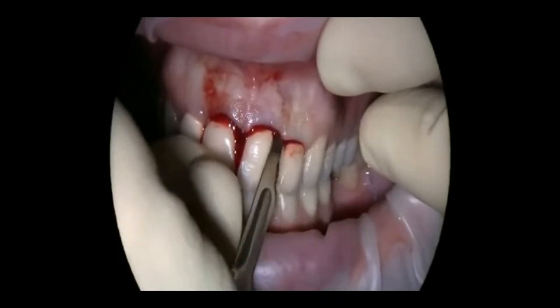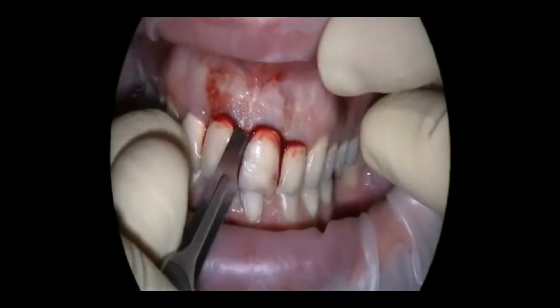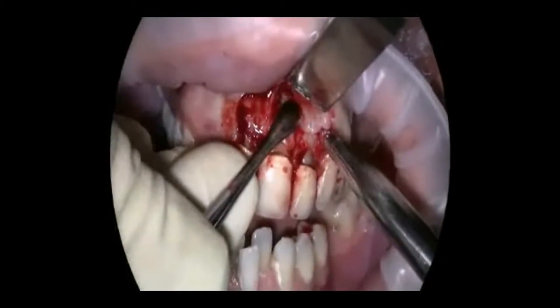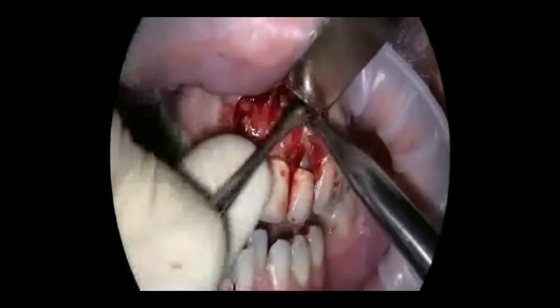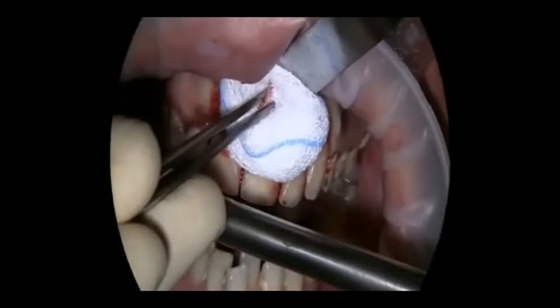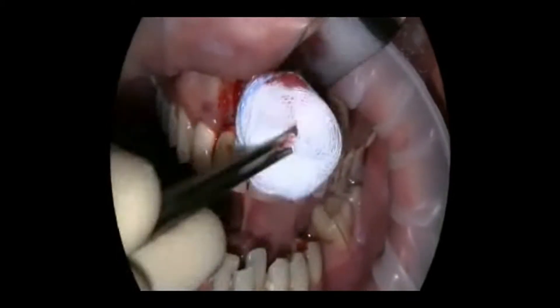First, the gum is folded back. You can see a gum edge cut. A mucosa lobe is prepared. You see the infection on the root tip and there is still no bone formation. Granulation tissue is removed and a medication to stop bleeding is inserted.